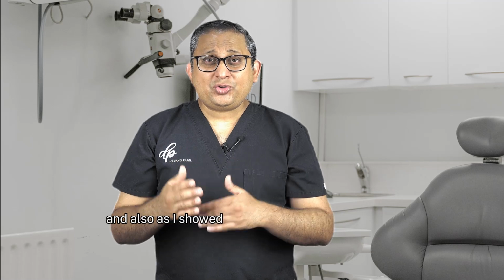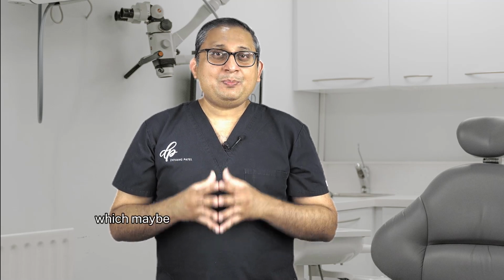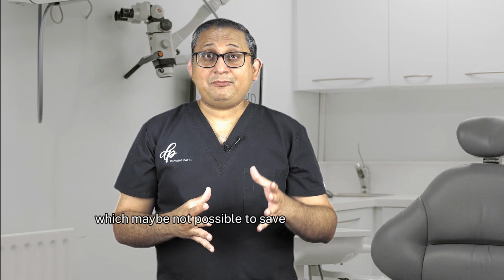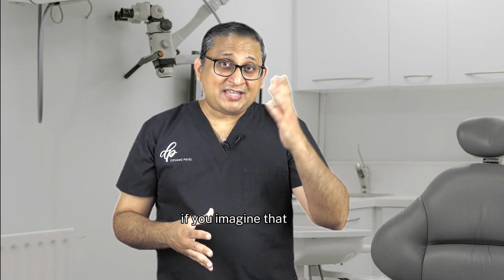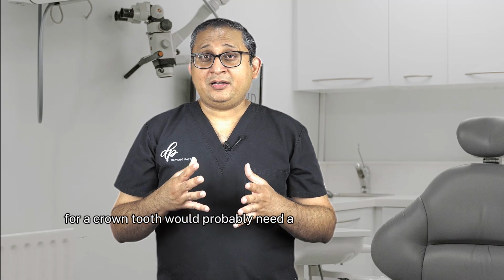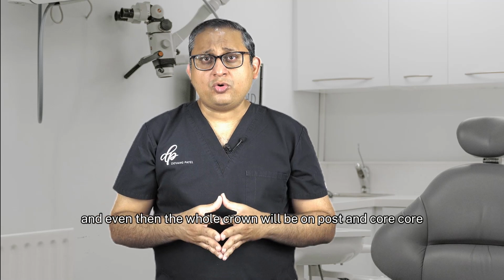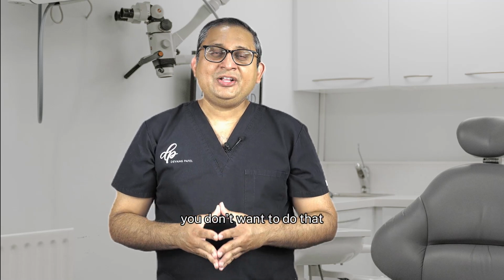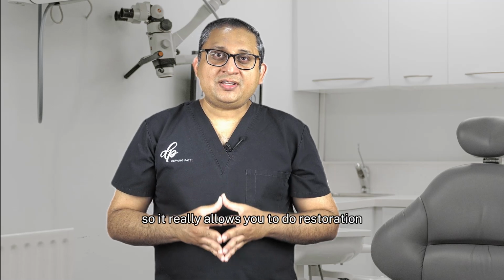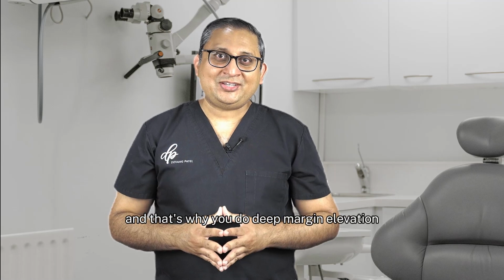And also, as I showed you in the example above when we were discussing what DME is, it allows you to save teeth which may not be possible to save by doing just a crown. If you imagine that premolar which we just saw, if I start preparing that tooth for a crown, the tooth would probably need post and core restoration, and even then the whole crown will be on post and core. You don't want to do that. So it really allows you to do restorations where it is not possible otherwise. And that's why you do deep margin elevation.